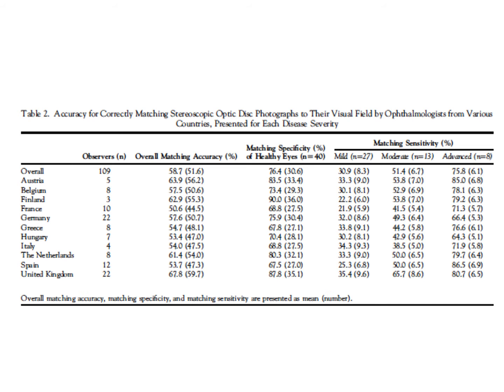When we split the overall accuracy into specificity and sensitivity, we observed that the specificity was overall 76, and the sensitivity changes, of course, based on the glaucomatous group that we choose. In the mild group it was very low, 30, 31, moderate around 51, and advanced was 76.